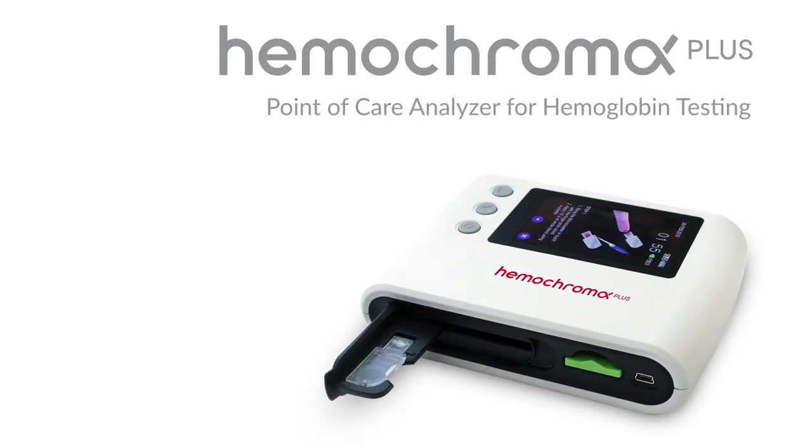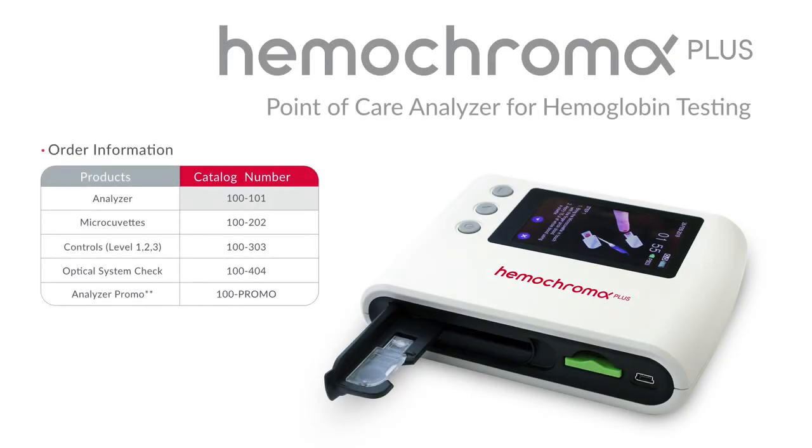The Hemochroma Plus Analyzer item number is 100-101. For more information, visit us on the web at Immunostics.com.